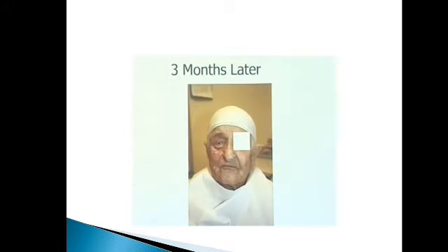It's an example of a patient that has a very huge BCC on her face, and she was treated with IMRT. It is 3 months later, and she is really good now. It's the first day of treatment and the last day of treatment.